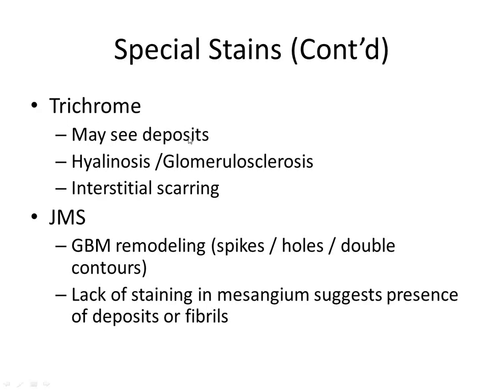If you're going to see them, it's usually going to be in the setting of a membranous glomerulonephropathy. So sometimes you're lucky enough and you can make that diagnosis based solely on histology, and there have been quite a couple of cases where I've told the clinician who has submitted the biopsy that we can call it on light microscopy, and if your owner has financial constraints, or you want to go ahead and immediately start treating before we get the EM back, we can diagnose it solely via histology, and that's helped a couple of our patients. And it's also saved some clients money.